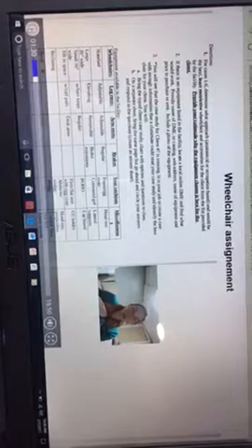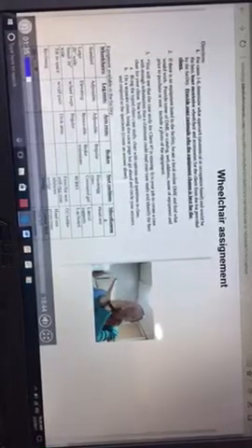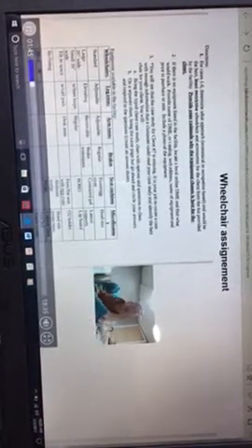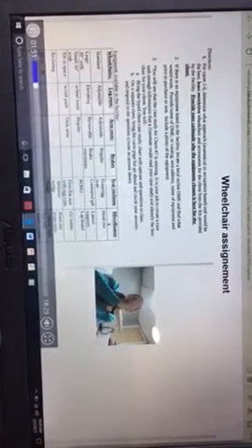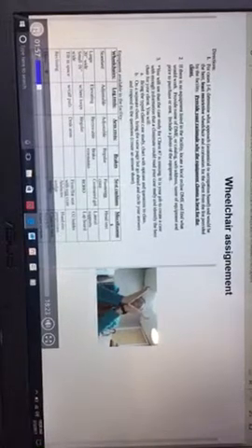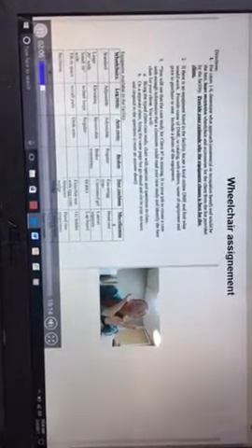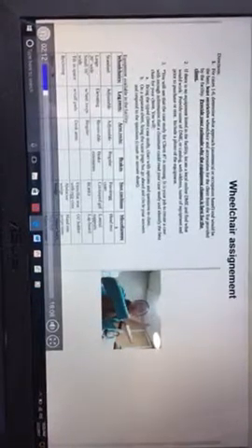And I think one really big thing to keep in mind is that tilt-in-space, when it comes to wheelchairs, stays at 90 degrees. This probably looks really awkward to you guys. It feels awkward to me. So it stays at 90 degrees. Okay, so you're sitting at 90 degrees. Here's the back, here's the seat pan. When you do a tilt-in-space, the entire chair is moving and tilting the person back so that they're taking the pressure off of their sitting surface, because that puts them at an extreme high risk for skin breakdown. So that's tilt-in-space. Tilt-in-space comes back up. It moves as one unit and allows for pressure relief.